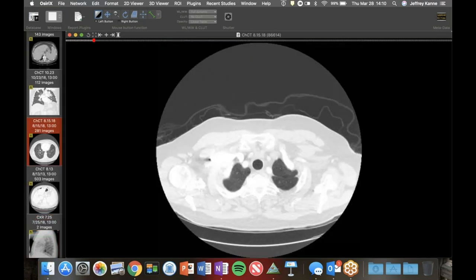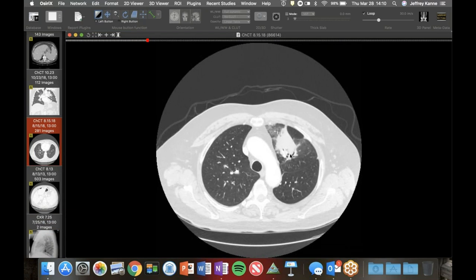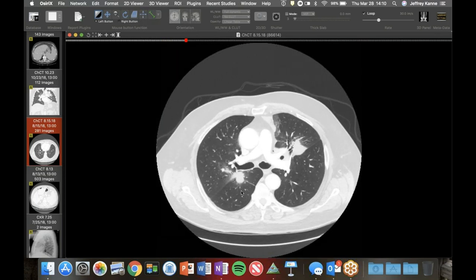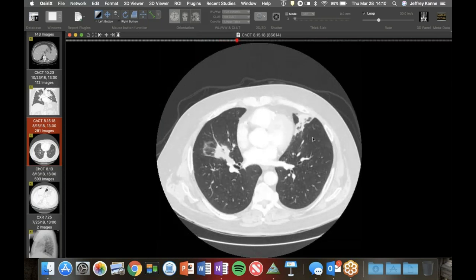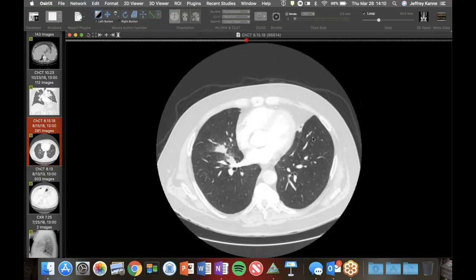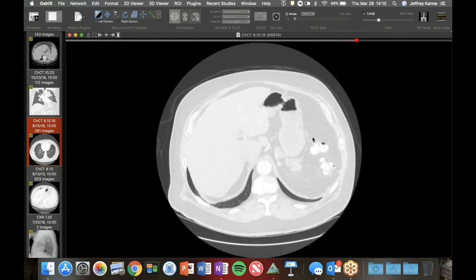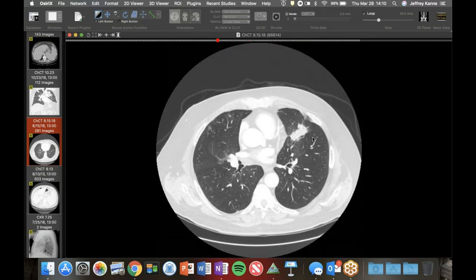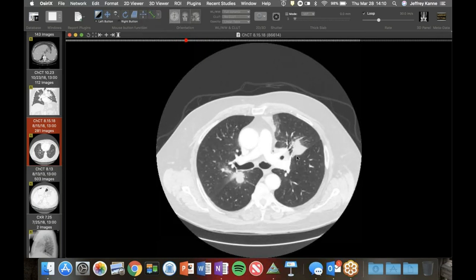They had a CT shortly thereafter. You can see these irregular nodules - this one more of a mass, quite large. Air bronchograms, which all of these have. This one looks like lung cancer - it's spiculated, retracting the fissure. Some have halos of ground glass around them. But in mostly all of them, the airways are relatively preserved. This was biopsied and showed recurrent lymphoma in the MALT tissue, which explains the association with the airways.